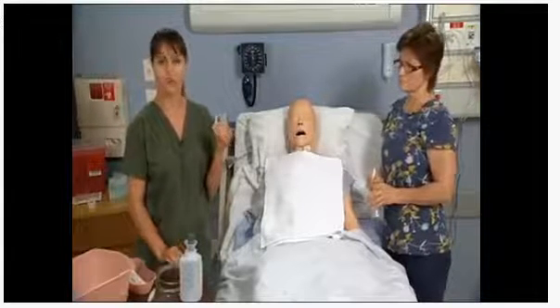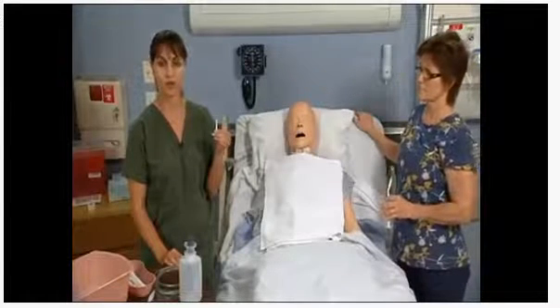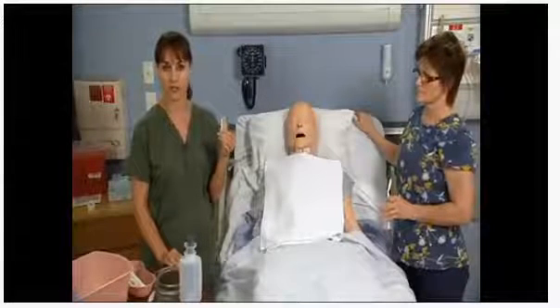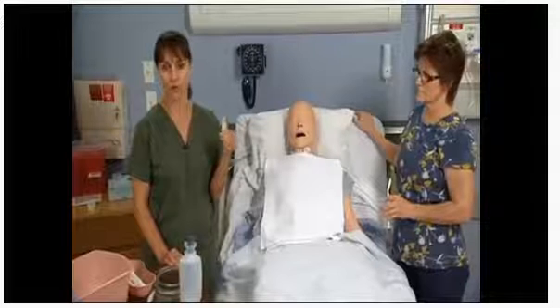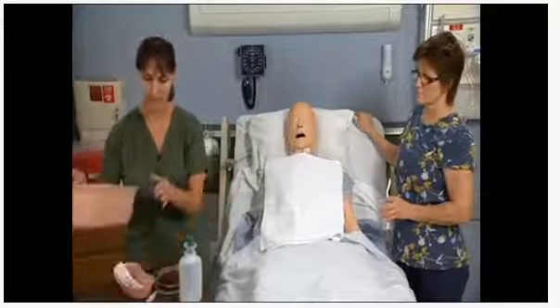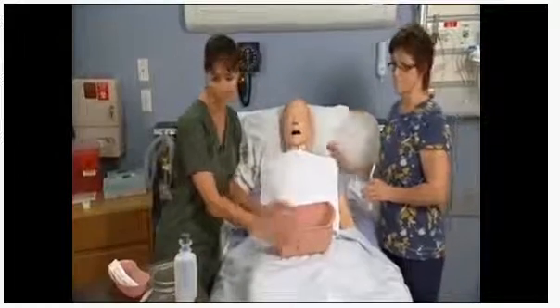You need to make sure that you check your agency's policy to see how they verify placement. Most agencies require a pH strip so you can make sure that the contents that you receive back is acidic so you can verify that you are in the correct place. I'm going to go ahead and put the bucket right here, just in case if my patient gets sick.